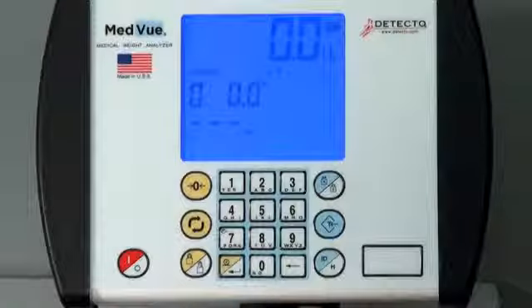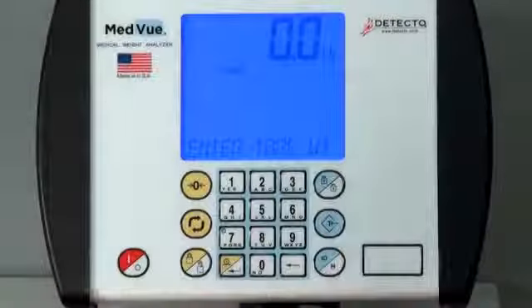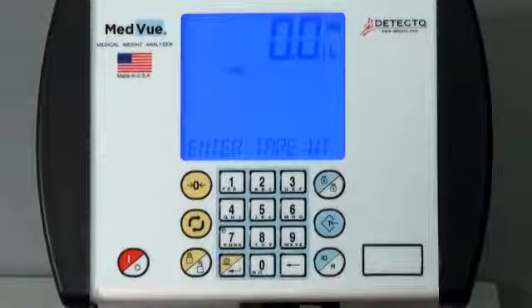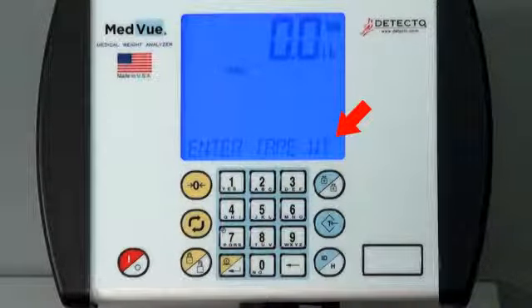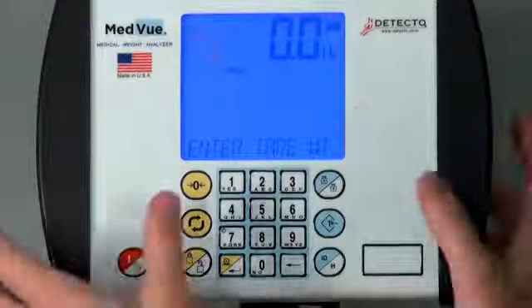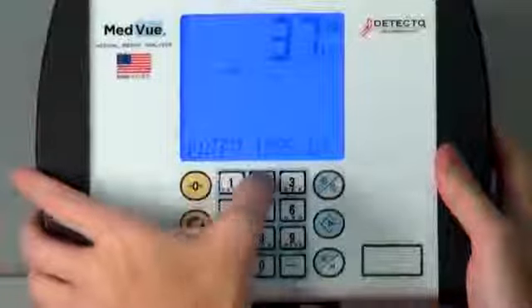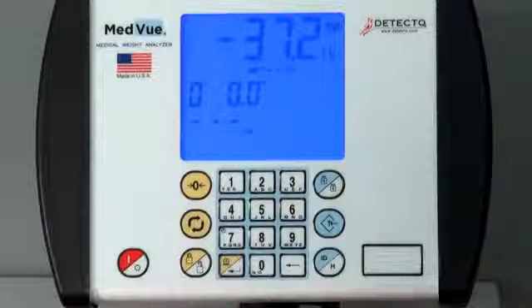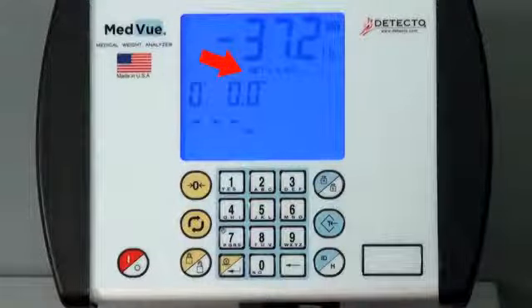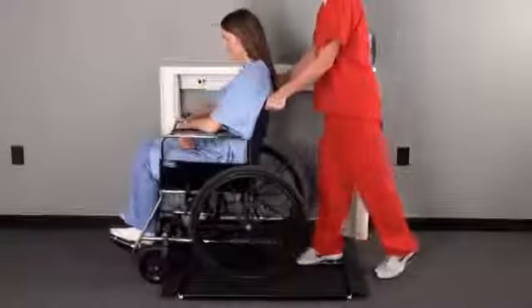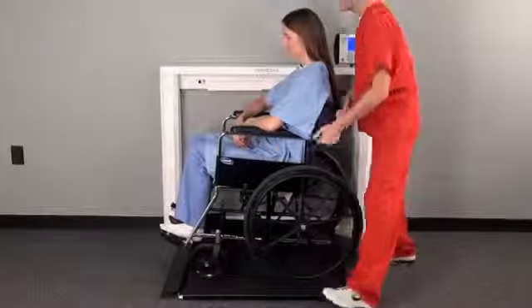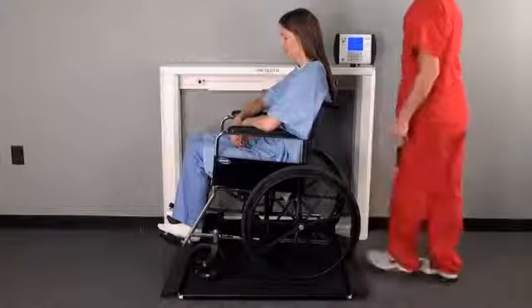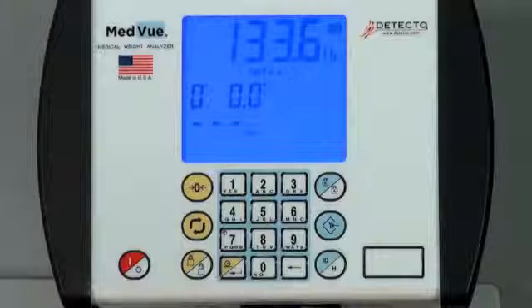When the tare weight of the wheelchair is known, simply press the tare key without any weight on the scale. The display will change to Enter Tare Weight and the tare enunciator will toggle on. From here, use the numeric keys to enter the tare weight and then press Enter. The display will then change to a negative weight value and the net enunciator will toggle on. You may now roll a wheelchair patient onto the scale and read their proper weight measurement. The weight of that wheelchair will have been removed from the readout and you will be able to accurately view the patient's weight.